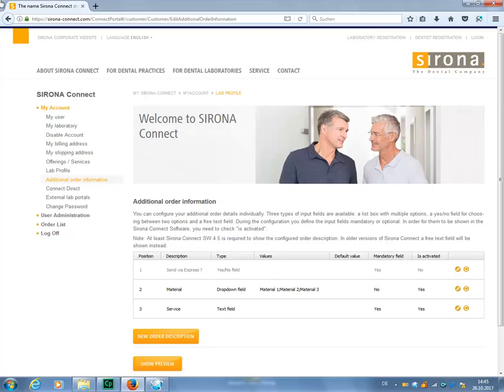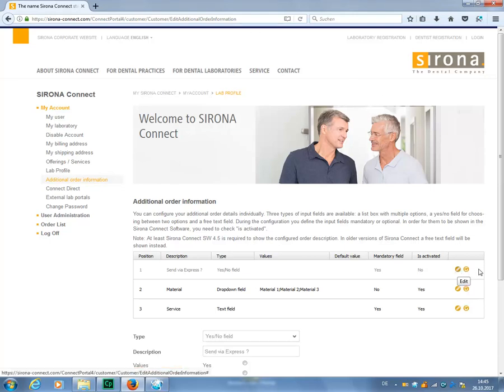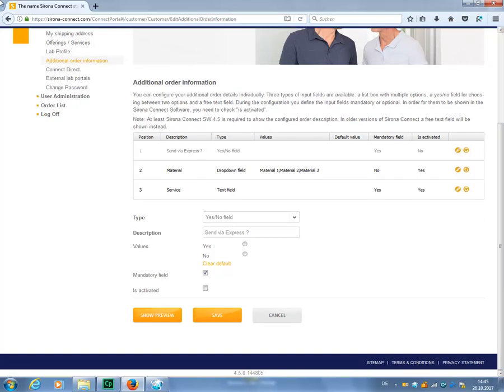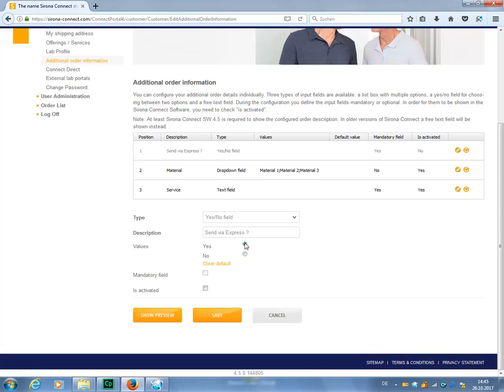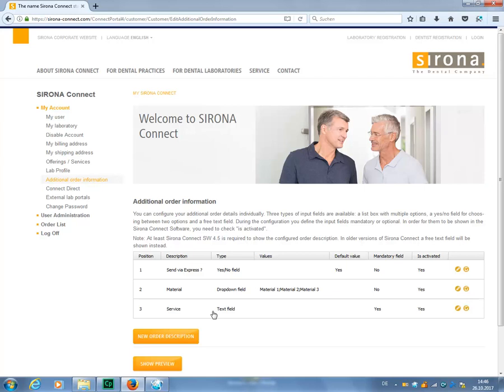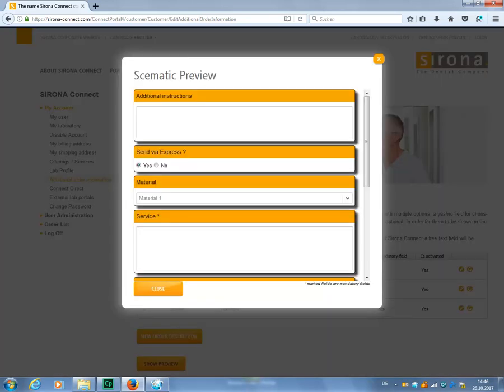We therefore need to go back to our lab profile and modify our settings so that it is also visible for the dentist in the Sirona Connect software. Here, you can choose to remove the additional order information by clicking on the Waste Bin icon, or edit it by selecting the pencil icon. First, let's make another change and specify a preset. Click on Clear Default to remove it automatically. Since we would like to show you this modification later on in the Sirona Connect software, we will select a preset again. Since we would like to make this order information visible to the dentist, we will enable the Is Activated checkbox. Finally, we save our changes. Before we switch to the view in the Sirona Connect software, let's take another look at our preview. Send Via Express is now preset to Yes in the additional order information.